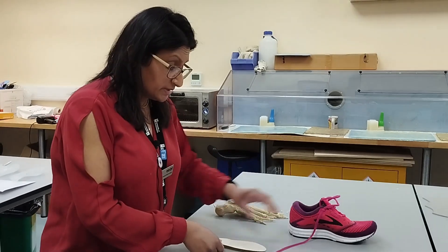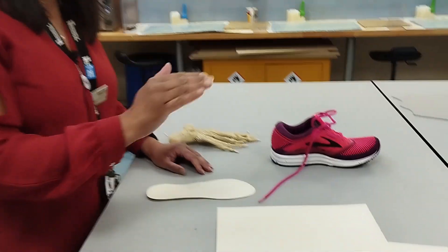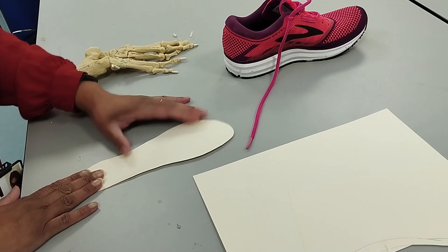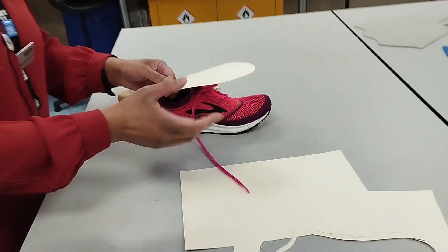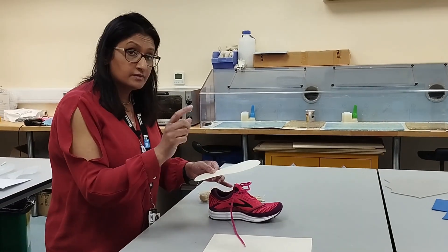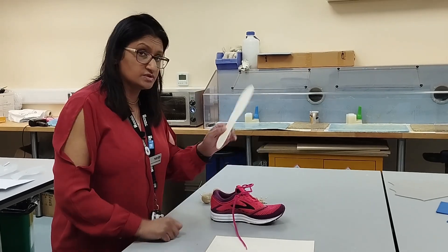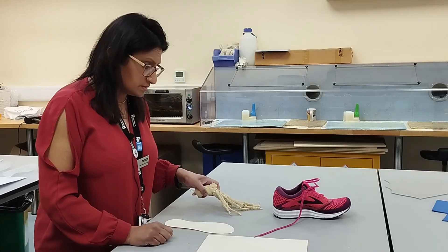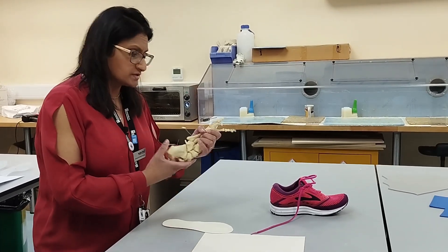In a real clinical scenario, you would mark the foot on the patient, then spray the template with some chlorhexidine very lightly, place it back in the shoe, and ask the patient to step in. Those pen marks would then imprint onto the template. However, for your OSCE station, you would gauge approximately where those marks are going to be.